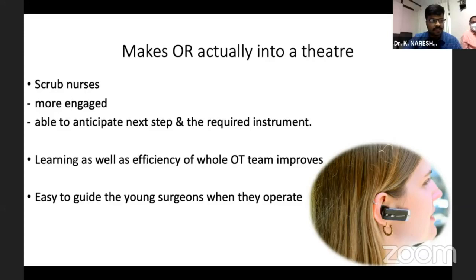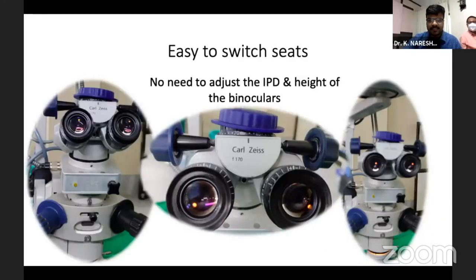It's easy to guide young surgeons when they operate. It is not now necessary to stand at the head of the patient and speak to the surgeon whom you are teaching. You can sit a few meters away and just guide him with the help of a Bluetooth. It is easy to switch seats.